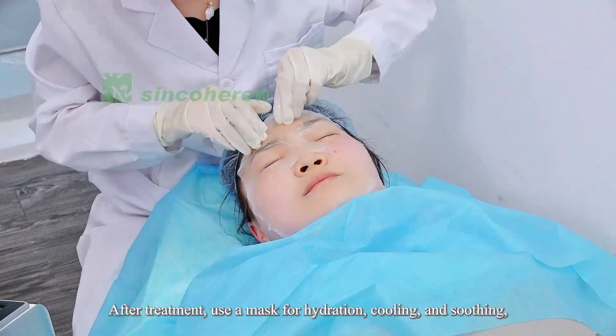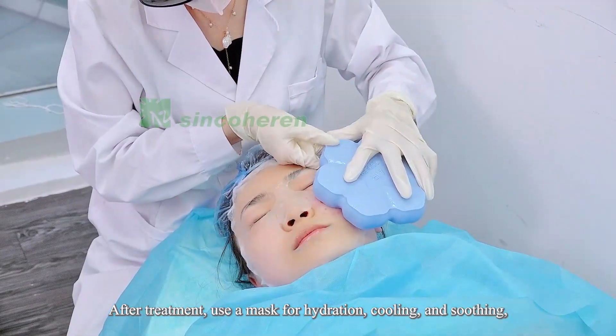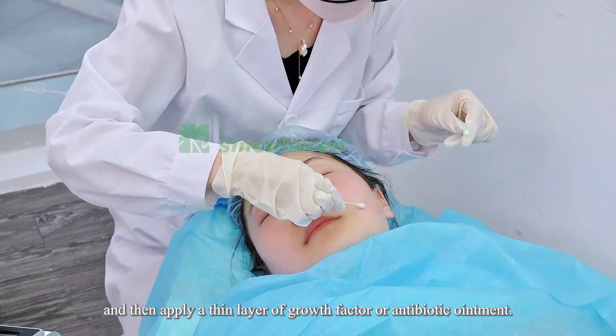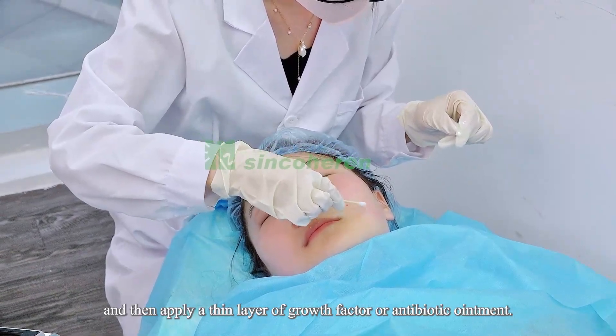After treatment, use a mask for hydration, cooling, and soothing, and then apply a thin layer of growth factor or antibiotic ointment.